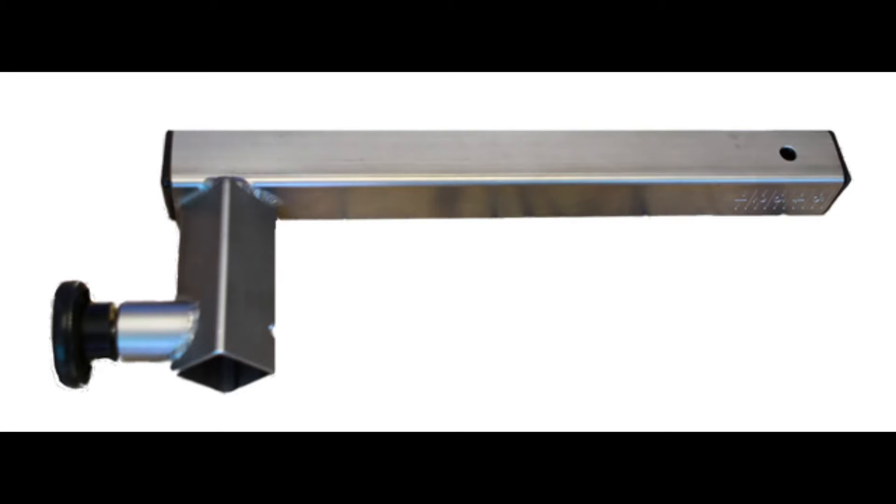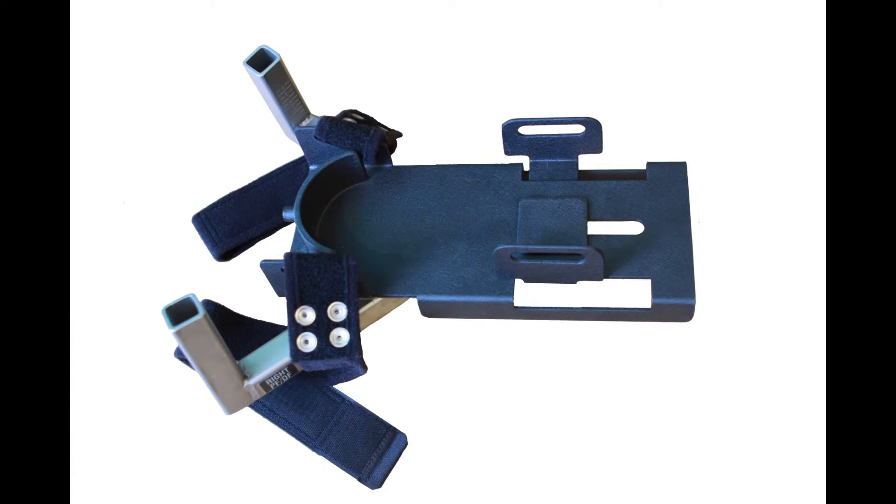For plantar and dorsiflexion we will need the ankle adapter and the foot plate. These are often left attached to one another.